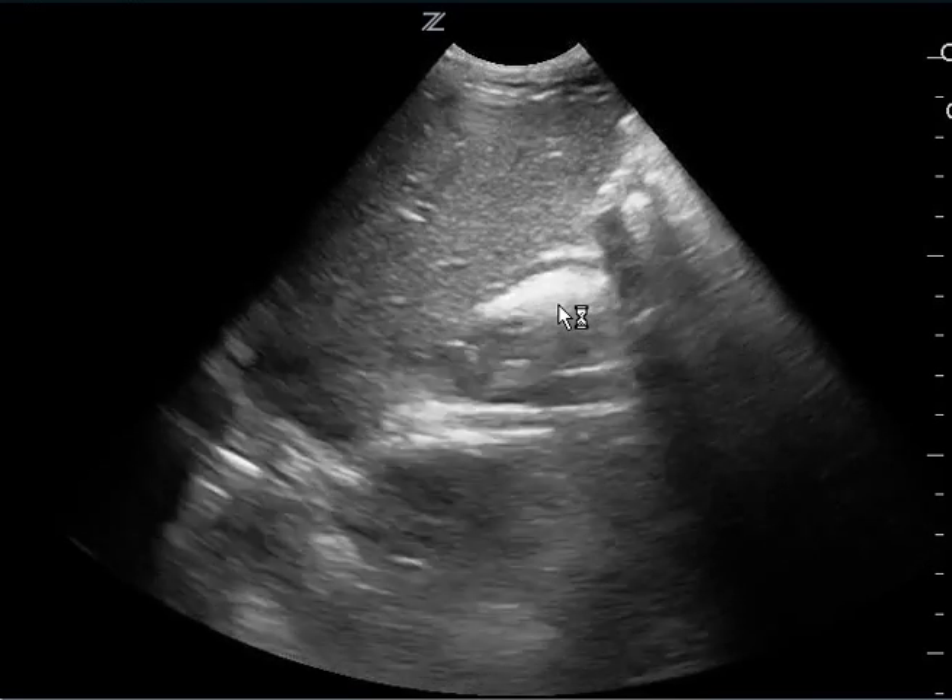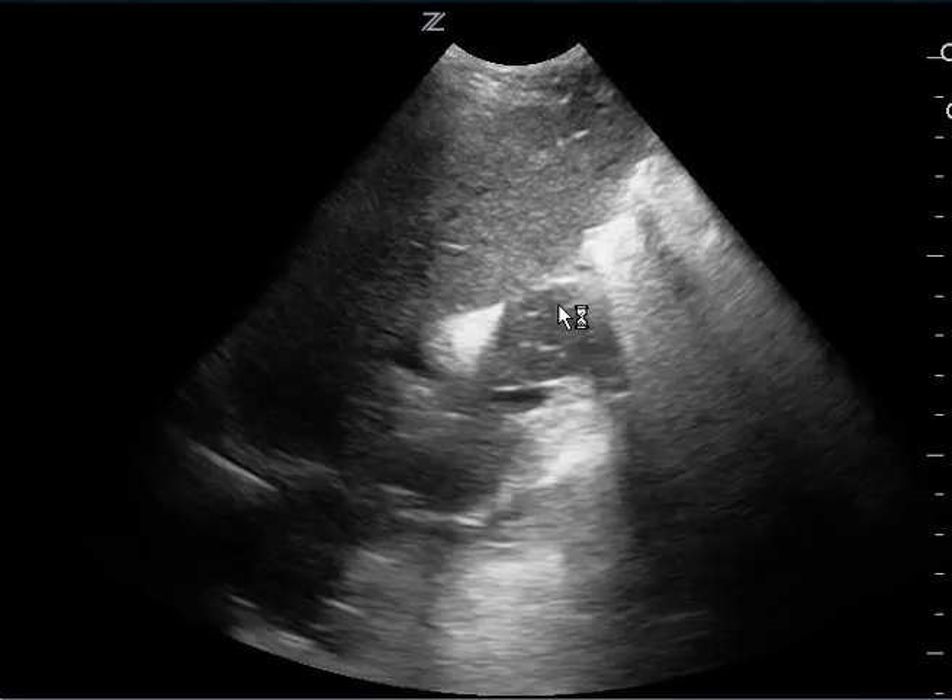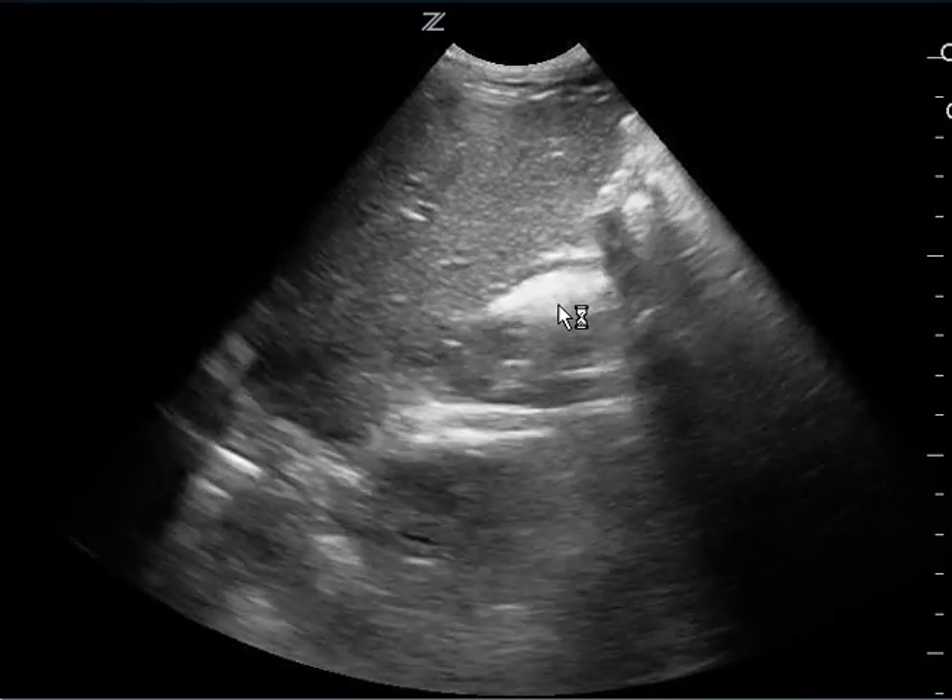Also, I would recommend trying to get a good view of the diaphragm and the spine so you can tell if there's fluid in the chest as well.